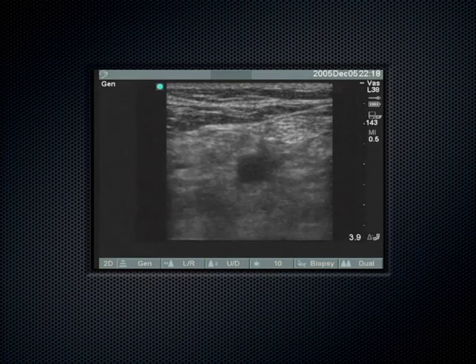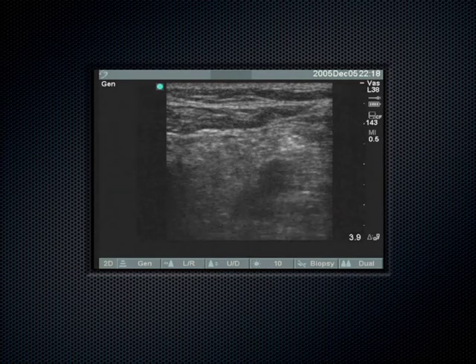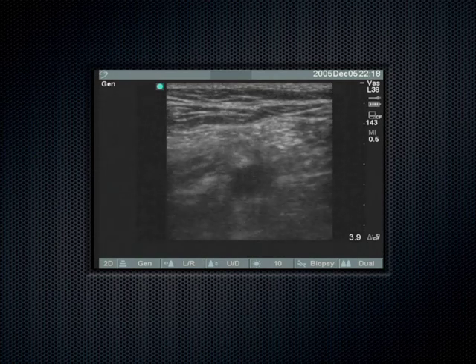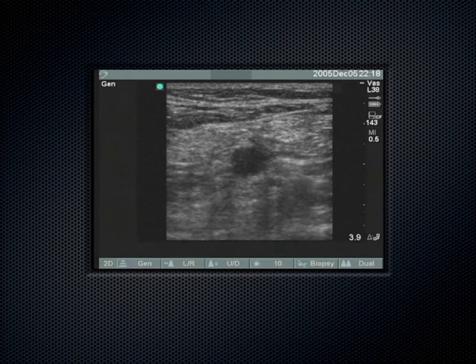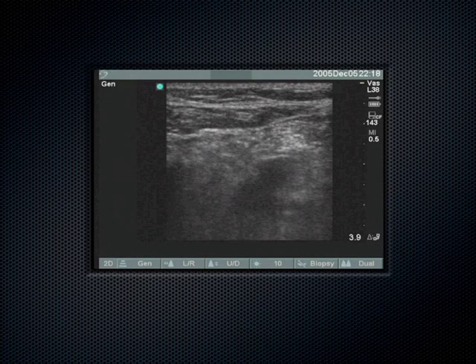Where are we? Hard to know. Turns out, now you know. See that? This kind of gets at the Frank Netter drawing a little bit, actually. Interesting, after I told him that you don't see this. I'm going to pause it when it becomes clear where we are, so we're pushing right there, and then there. So this is the popliteal fossa.